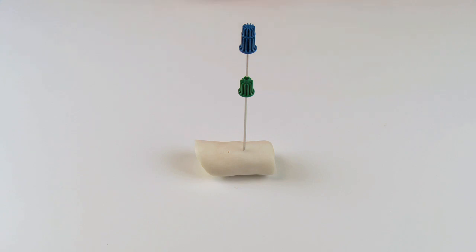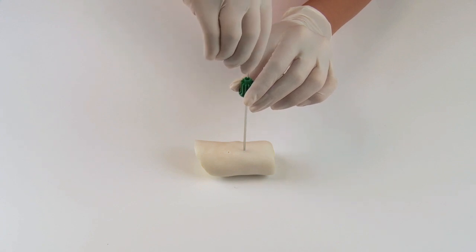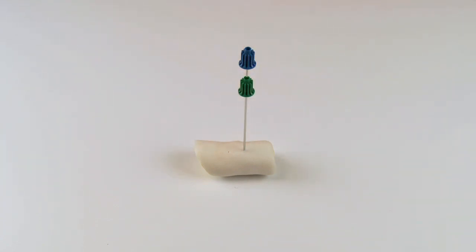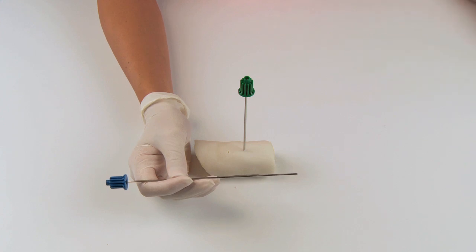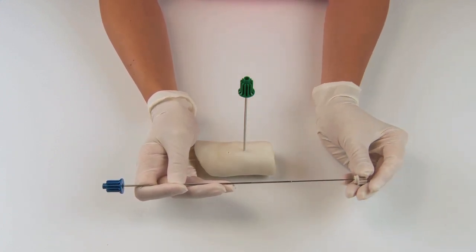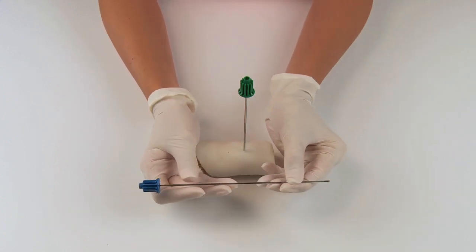Remove the stylet and now rotate the biopsy needle clockwise while applying slight downward pressure to the stop. Remove the biopsy needle to retrieve the sample. The blunt edge white cap ejector pin is inserted into the distal tip of the biopsy needle. The sample is pushed out through the lower opening of the cannula hub in order to avoid crushed artifacts.